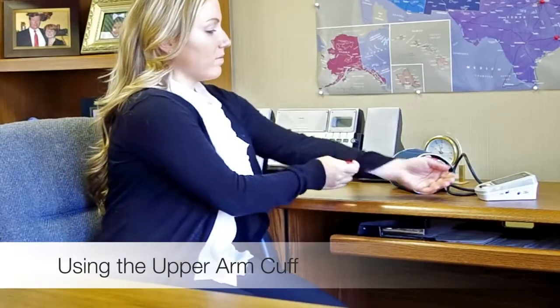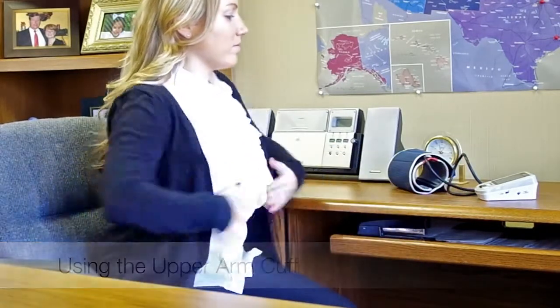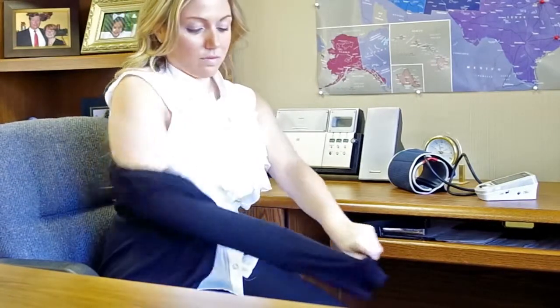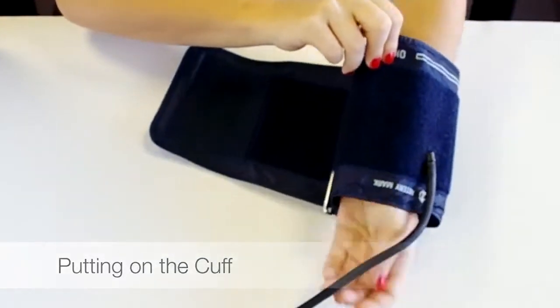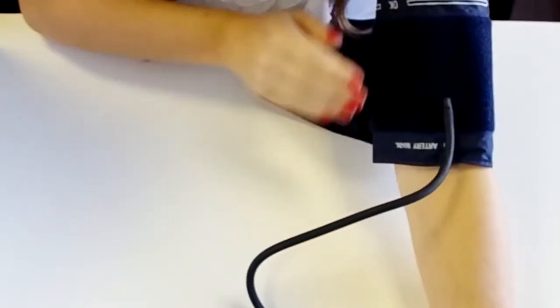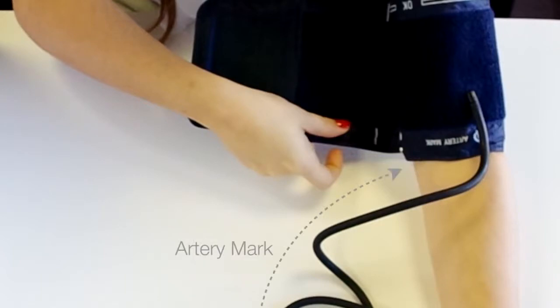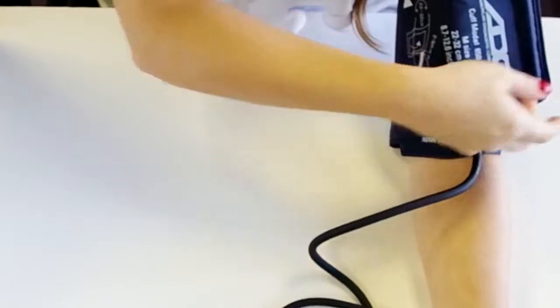Avoid placing the cuff over clothing. If you have loose sleeves, you may roll them up. If they do not roll to the shoulder or constrict the arm, remove the garment as it may impede measurement. Extend your arm out, palm up, and keep it relaxed. Put the cuff on your upper arm about one inch or two to three centimeters above the elbow crease. Each ADC cuff is labeled with an artery mark, which should align with the artery that runs down the center of your arm.